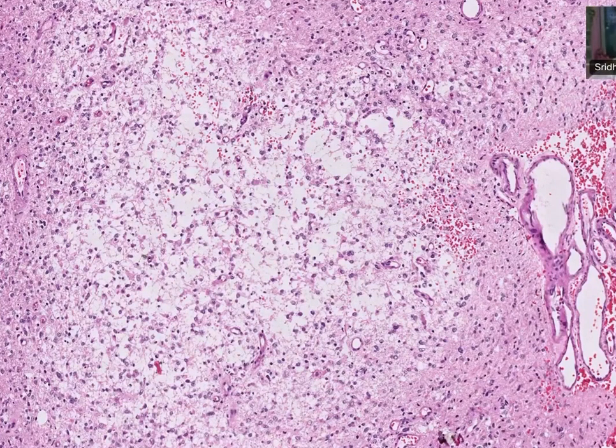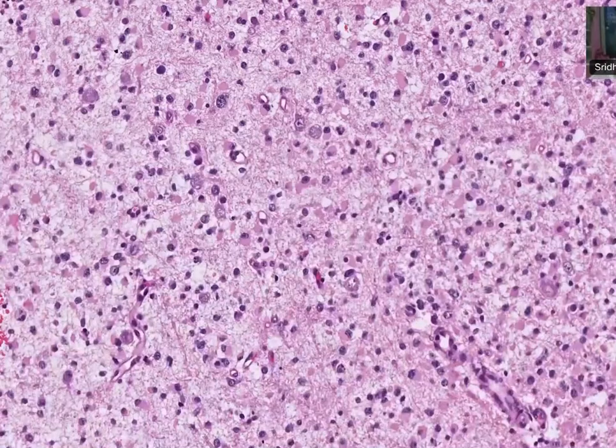First, you talk about the cells, then you can talk about the fibrillary background. There is cellular pleomorphism, sir. There is hypercellularity. First, tell me the shape of the cells. How are they? They are eosinophilic. In this, you can elaborate the cell morphology. Describe this area.